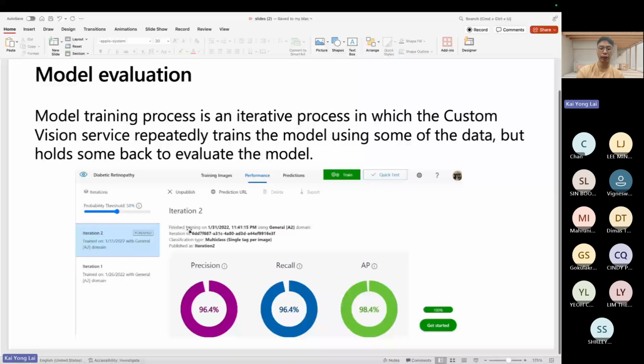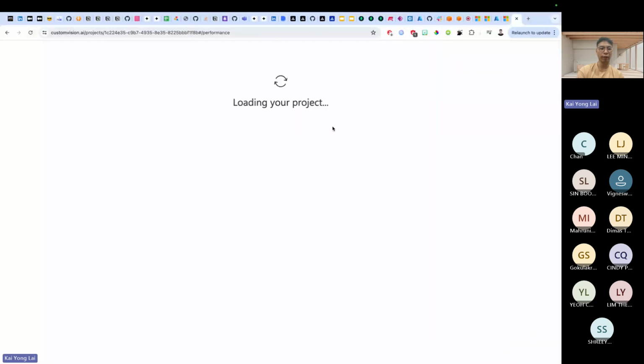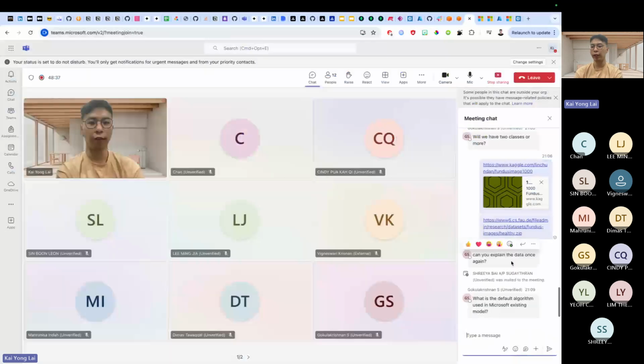Microsoft Custom Vision will show you the precision rates, recall rates, and the AP rates of how your models work. And it will have information on what the values mean. Okay, so we will let it run for a while, where I will show you guys how it looks in real action. I'll give it a couple, maybe 1 or 2 minutes. But in the meantime, if you guys have any questions or you need any help, then you can let me know, right?